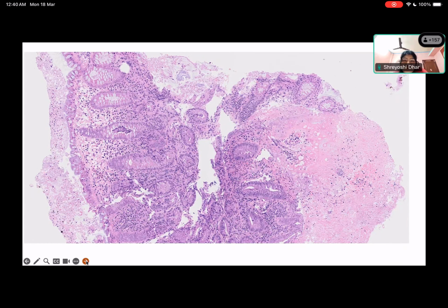The section shows some tubular crypts having single layer of the columnar cells and the goblet cells supported by the lamina propria. In the overall section, we can see that there are ulcerated slough in the luminal aspect, and also in the right side of the section, numerous fine vacuoles of the cytoplasm can be seen, giving a foamy appearance. And few ingested RBCs are also seen in that portion. So the overall histomorphological features are suggestive of amoebic colitis.